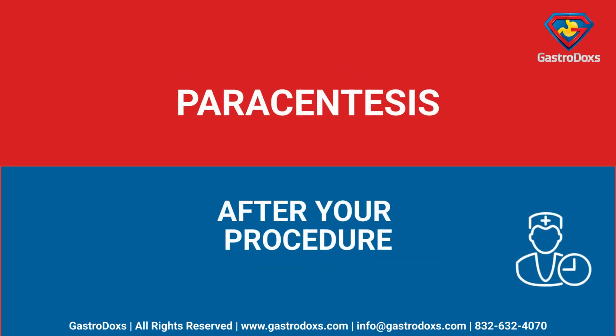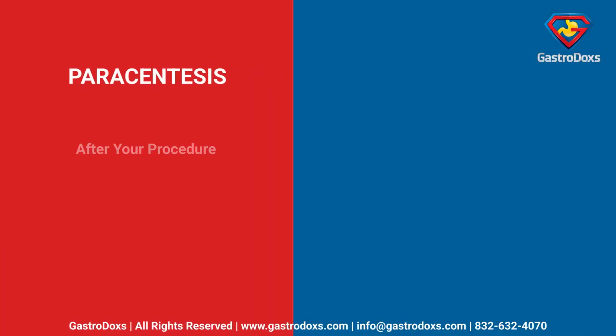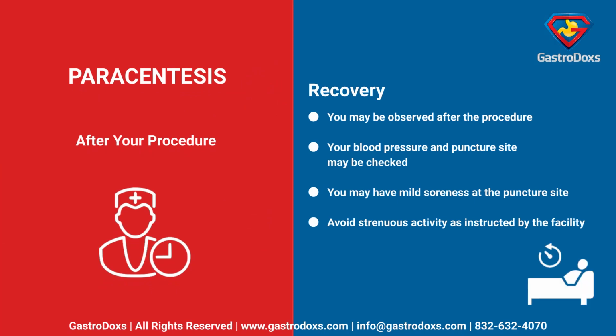After your procedure. Recovery. You may be observed after the procedure. Your blood pressure and puncture site may be checked. You may have mild soreness at the puncture site. Avoid strenuous activity as instructed by the facility.